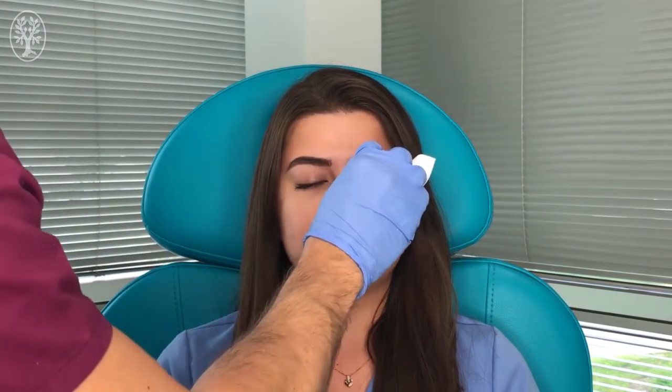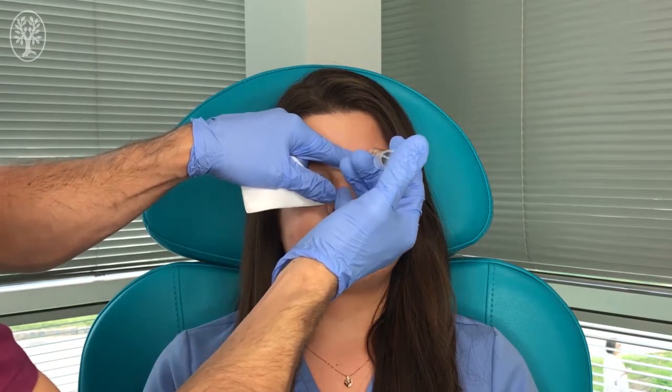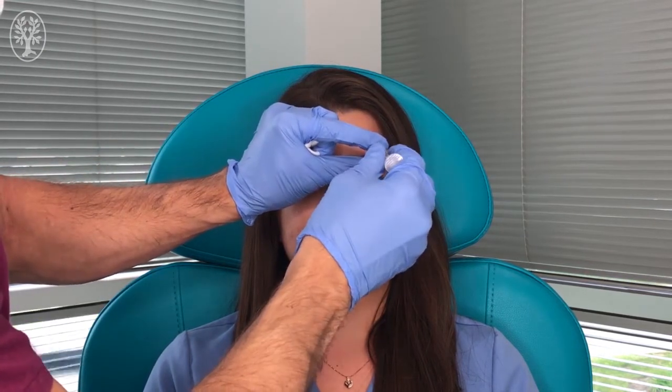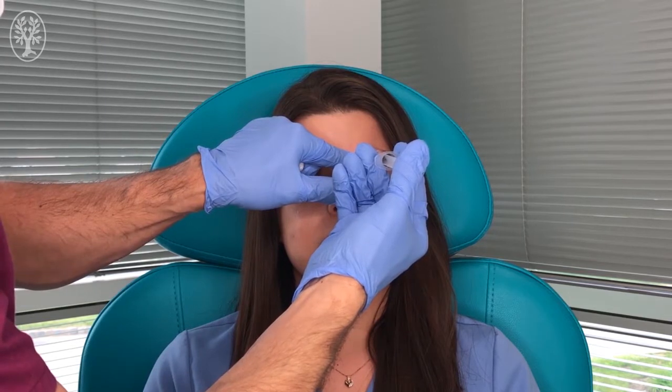After we have numbed the face, we can do the deep injection. For that, we're going to change the needle and use a larger caliber hypodermic — a 27 gauge needle — and go perpendicular to the forehead in the area that we already pre-numbed. I'm going to go straight down to the bone. We aspirate to make sure we don't hit any vessels, and we create a wheal of local anesthetic about one centimeter.